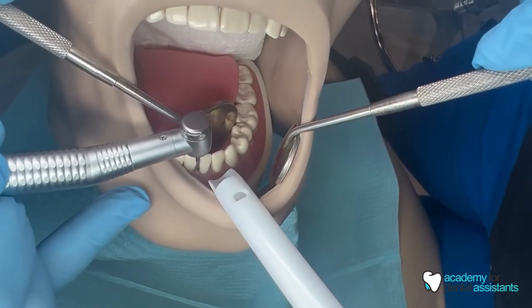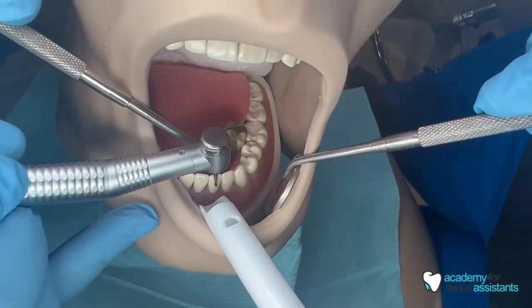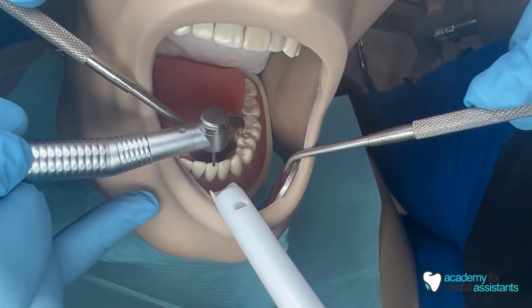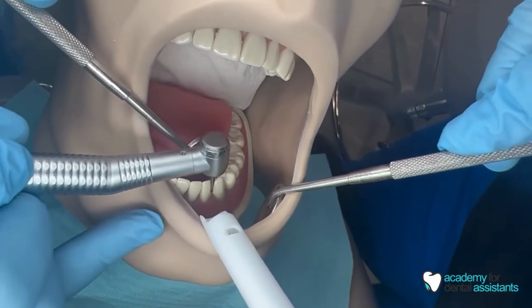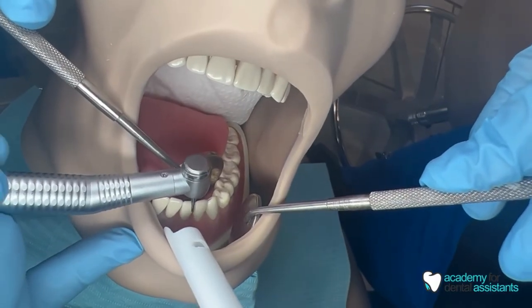Now the doctor is working on tooth number 24. You can use the HVE to retract the patient's lips if needed. You just want to make sure that you're extra careful not to rest the HVE or bump it against the patient's gums or tissues, as over time that would cause them pain and discomfort.